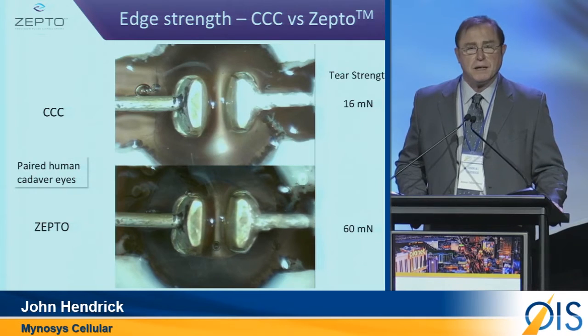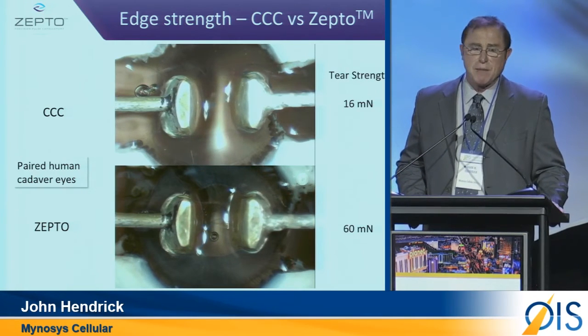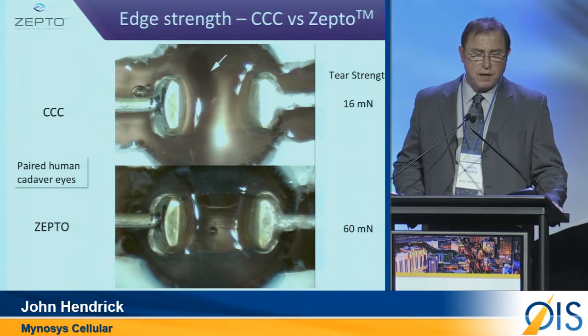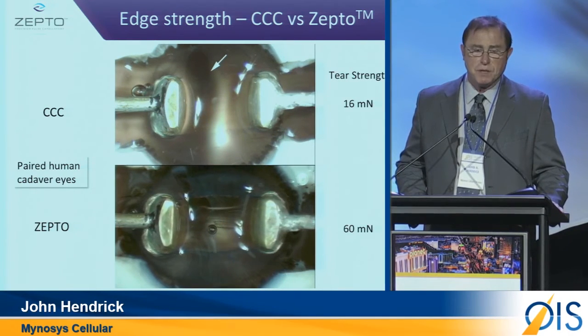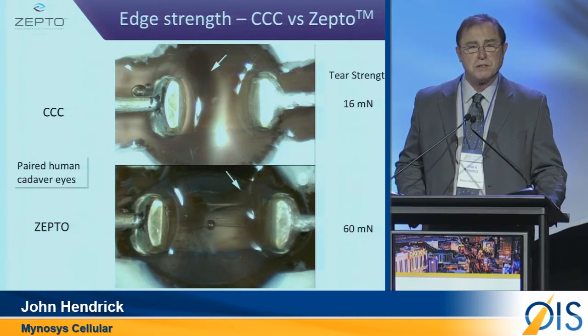In this video, in paired cadaver eyes, we're testing the strength of the capsulotomy. The top is a CCC, and there you see a tear. The bottom is Zepto. The end result in this one pair of cadaver eyes: a significantly stronger capsulotomy.